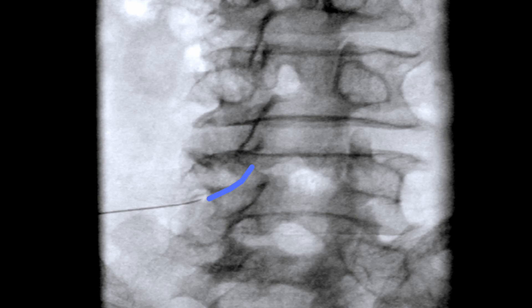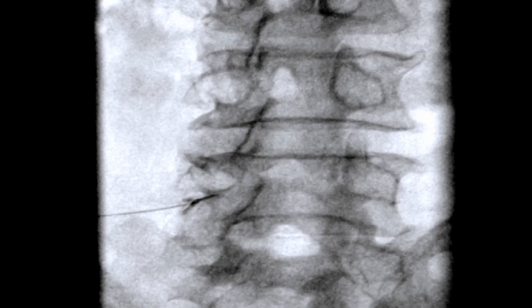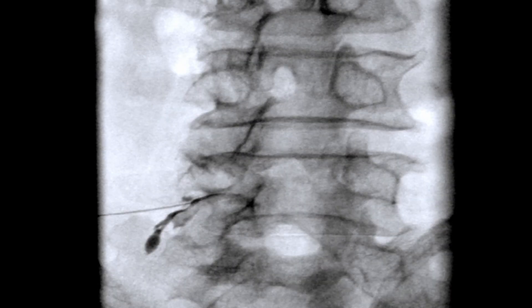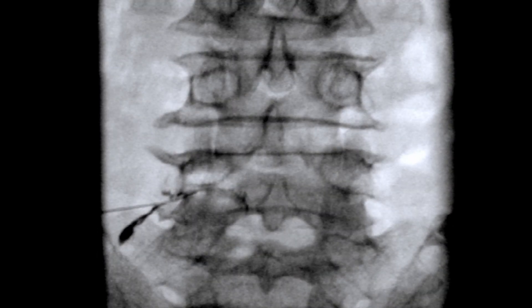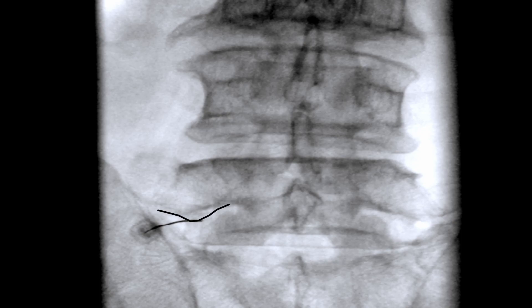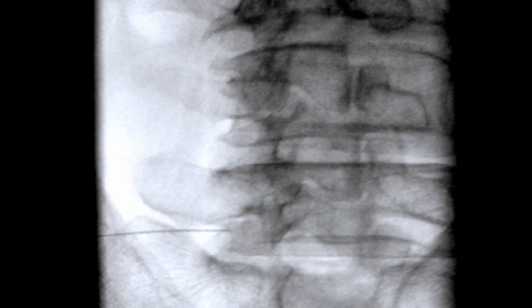It's essential to be adaptable and ready to deal with various anatomical differences, whether it's the downward elongation of the transverse process, the outward growth of the superior articular process, or situations where the C-arm requires a considerable upward tilt. During a previous session, we observed the needle veering off its course, influenced by the subtle contour of the transverse process's lower edge, causing it to miss the optimal position.